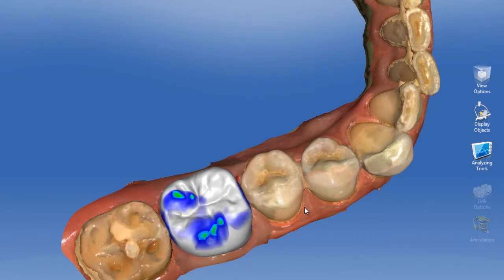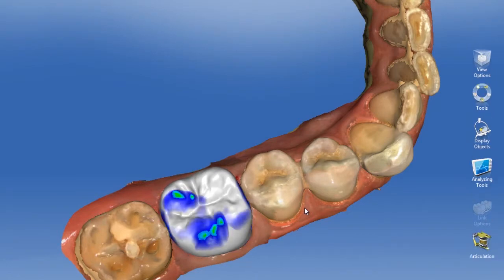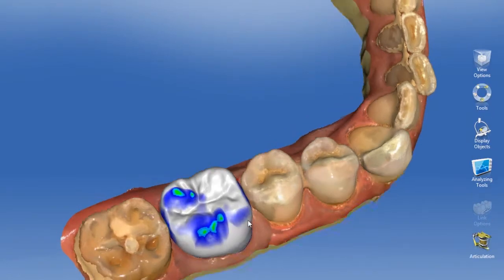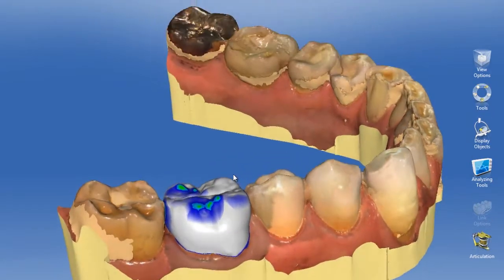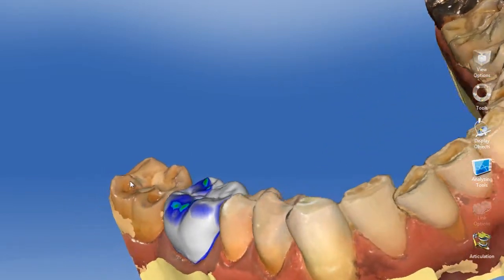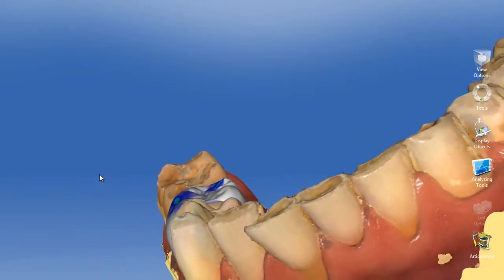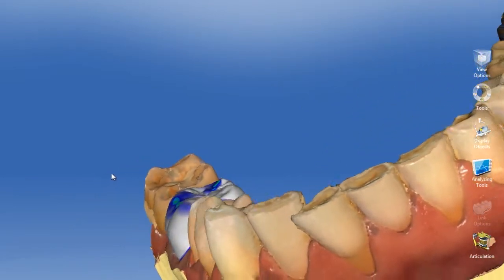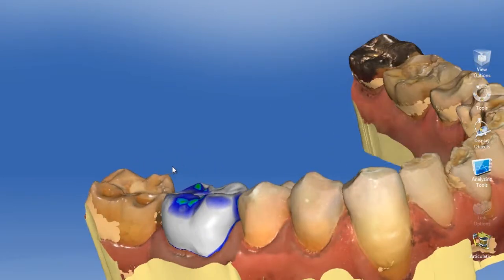This particular patient has a lot of wear patterns throughout his mouth, and we're going to use a new feature — the articulation feature — to actually analyze those.